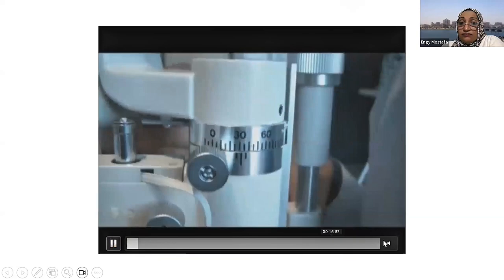So the direct illumination can as well give depth perception of the lens itself. How is that? You have to move the viewing system and your focus onto the lens while using the optical section. This is the optical section, that's ours.